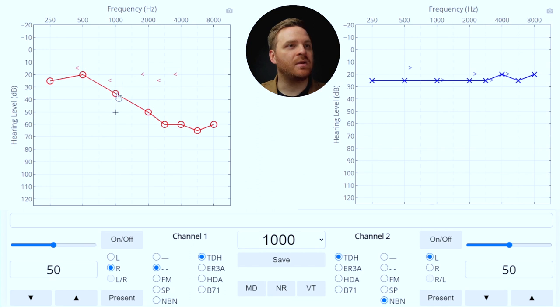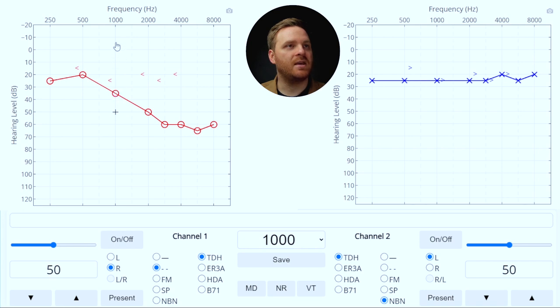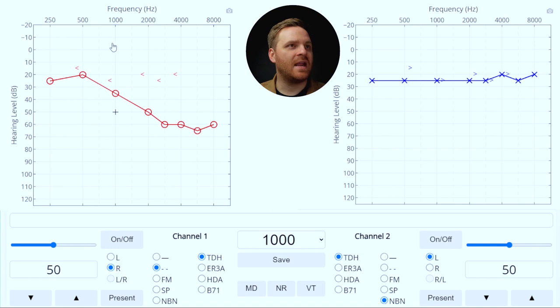At 1000 Hz, we played the sound at 35 dB HL. The hearing loss is starting to slope down and get a bit more severe. A 35 dB HL sound loses 40 dB interaural attenuation as it crosses over from the test ear to the non-test ear, arriving at negative 5 dB HL. Negative 5 dB HL is not audible at 1000 Hz by bone conduction or air conduction, so there's no need for masking at 1000 Hz.